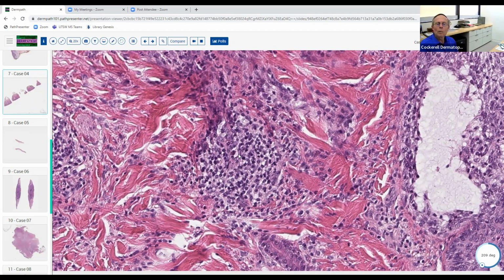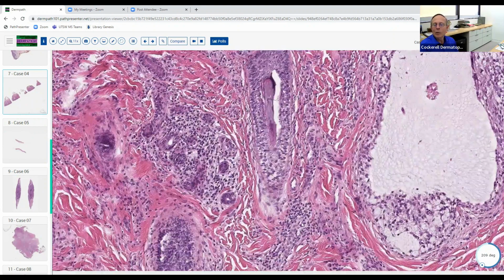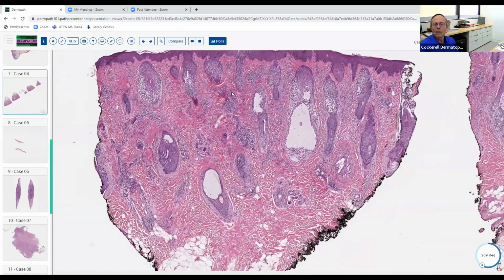And what were most of the cells? So I saw, at least for the inflammatory cells, mostly lymphocytes. And I may have seen an EO or two. Good, excellent. There were definitely some eosinophils in here also. Not as easy to appreciate on the scan slide, but there are EOs in here also. So what's the pathologic process that we're seeing here?